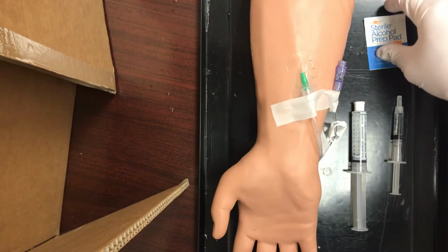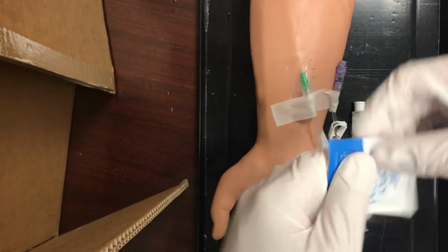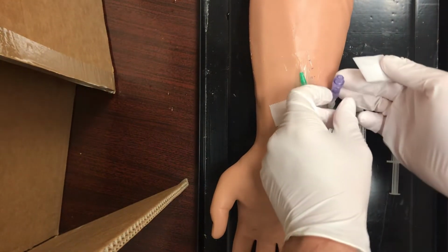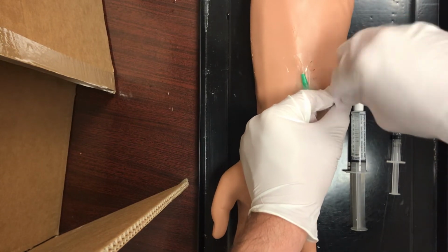Okay. Next, we're going to open up our alcohol prep pad. We're going to take the hub of the lock, and then we're going to scrub this for 15 seconds vigorously.